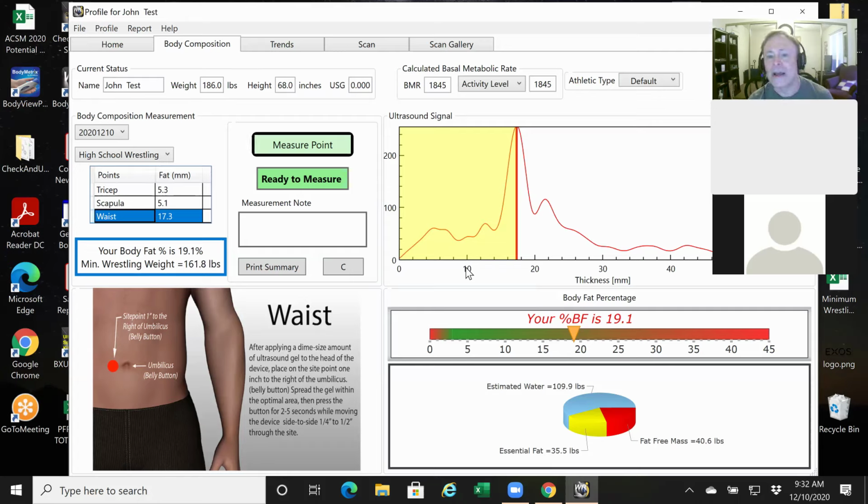The default setting simply tells the software to look for the first strong peak beyond 10. And in my case, it picked it out because people that have excess fat, trust me, they're going to be beyond 10 millimeters. I hope that provided a little more clarity as to how lean and default affects this. At the end of the day, guys, lean and default really don't matter as long as you're analyzing this graph correctly.